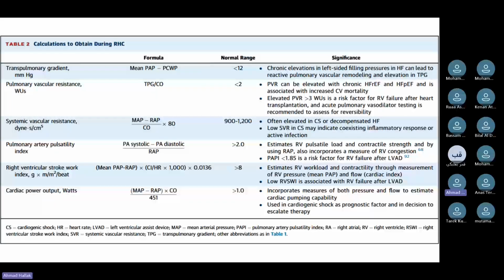And these are some important equations that, again, it's important to understand the concept of. Honestly, most people don't memorize them, because you can just save these equations and algorithms in an Excel file, input the numbers, and it calculates it for you. But again, it's important to understand the concepts that go behind them, and each one of these has a clinical relevance.